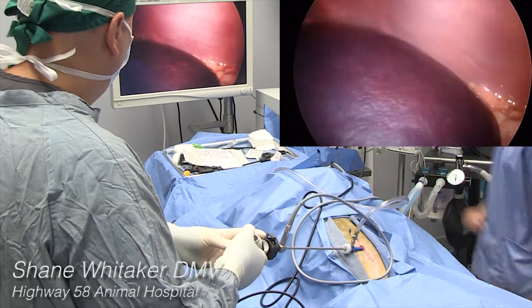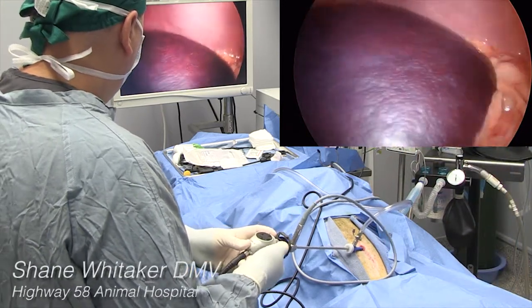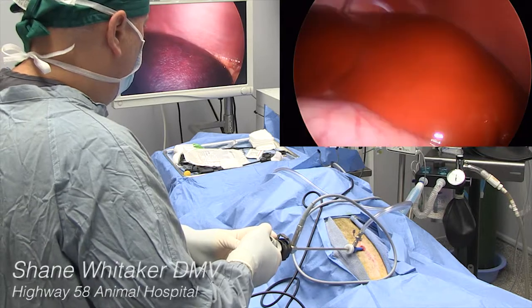The 5mm high-definition scope magnifies images times 30 and easily moves around the abdomen, showing the lobes of the liver, the gallbladder, spleen, and bladder.